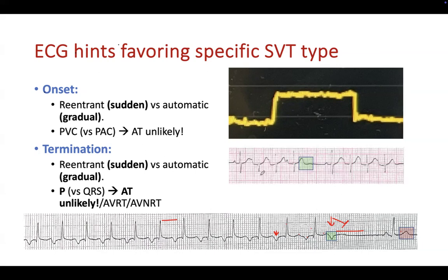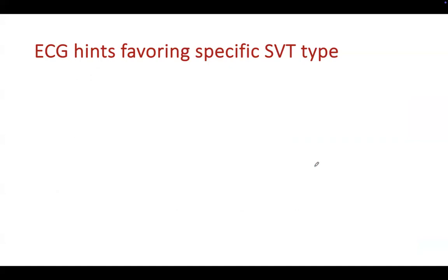If you remember, I showed an atrial tachycardia patient before, and if you noted the rhythm, it terminates with the QRS. So you have a sinus P wave and then a burst of tachycardia, but there's no P at the end. That's more typical of atrial tachycardia. The tachycardia decides to stop, goes down to the QRS, and that's it. So termination of the rhythm is also important to figure out the type of SVT.